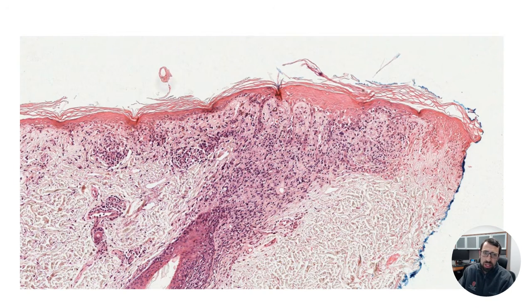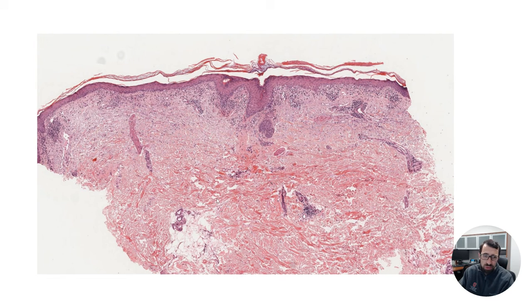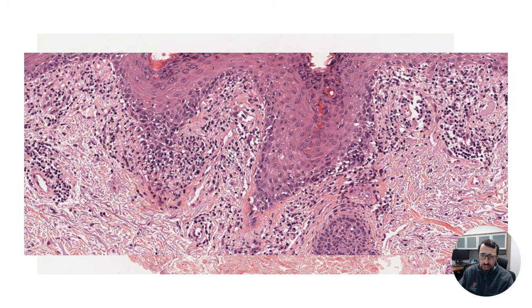So what's unique about here is it's, again, an interface dermatitis. What they'll feed you, though, for boards purposes is that if there's prominent dyskeratosis, so dead keratinocytes, and an extension of that down a hair follicle, which you can see it's extending down here, they're trying to feed you GVHD. Here's another slide, a punch down to deep reticular dermis.